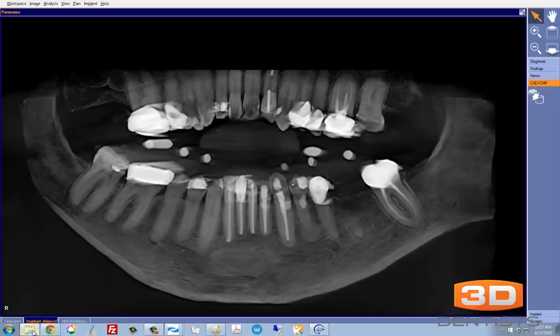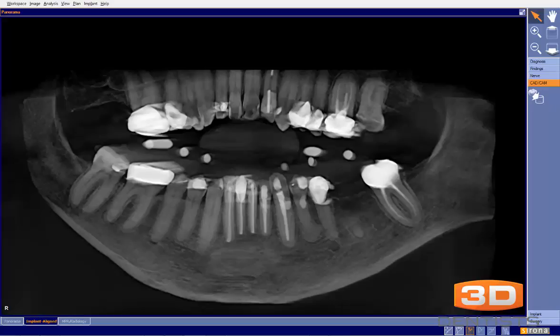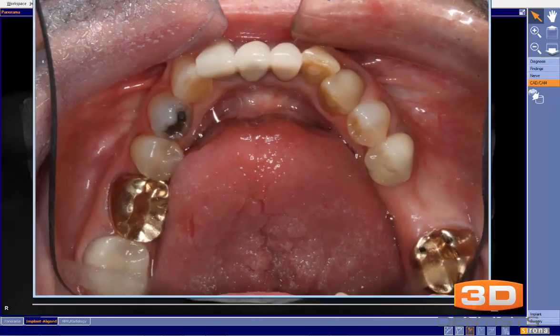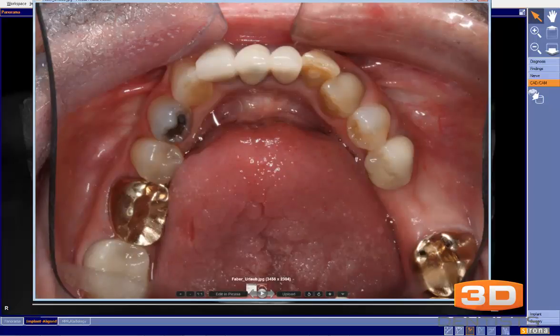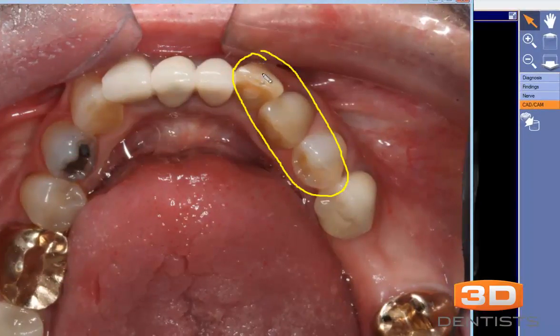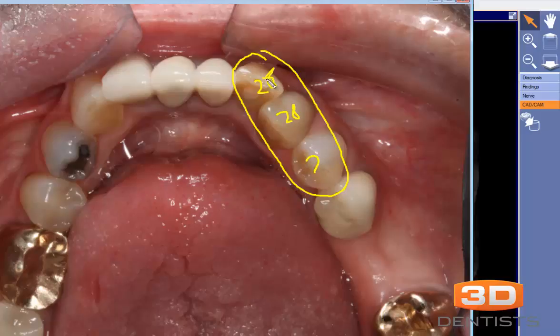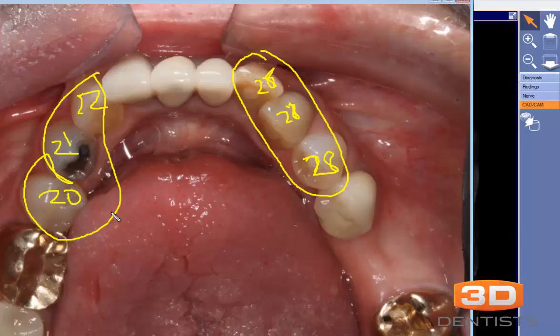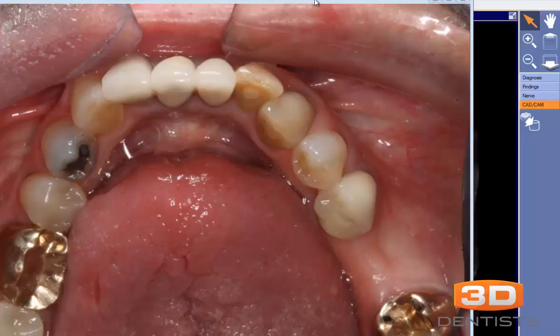To be a little more specific on this one, a photograph of this particular patient was also submitted. With that photograph, we can see that teeth 28, 27, 26, 22, 21, and 20 are all integrable. By that, I mean these are natural teeth that could be used to bring in our CEREC scan. So when we're bringing the CEREC data, we would want to focus on using these teeth as our integration points.